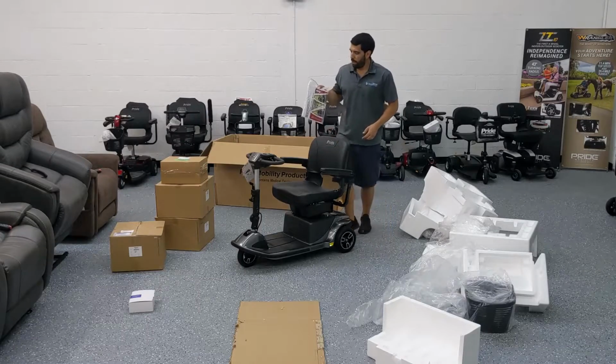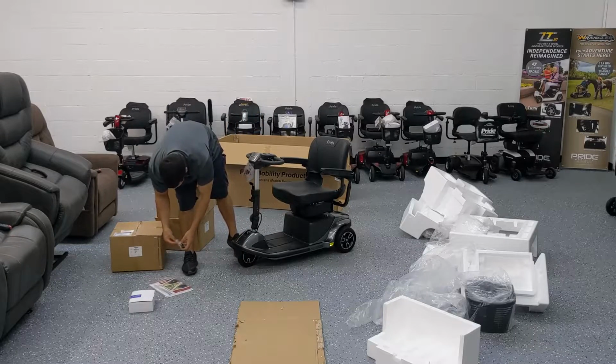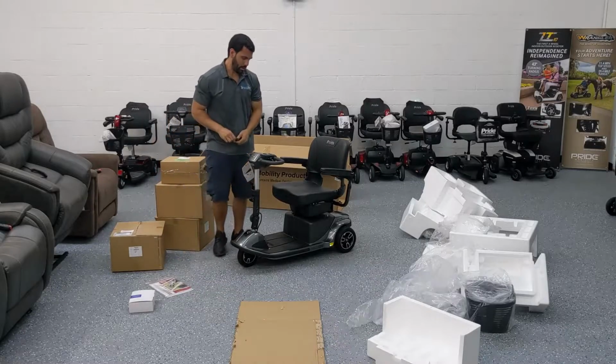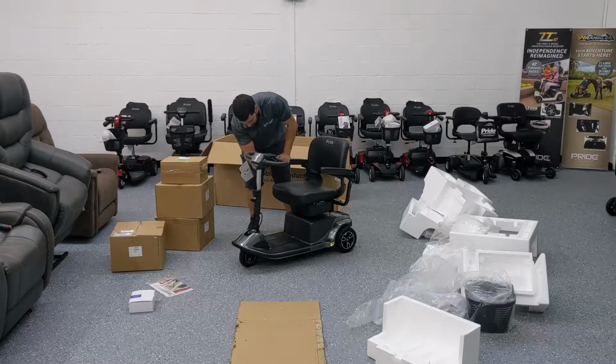In the user manual bag that we took out earlier, you'll find there are some keys. Go ahead and take the keys out. It comes with one spare, and the ignition is on the right side of the handlebar. Put it in, turn it, and you will have power.